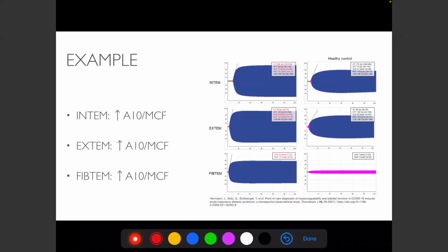So then they may not have gotten their complete dose, and you may or may not be privy to that information when they come out. Right. So rather than just incorrectly dosing for the heparin weight that you got in the OR, because everything's so standardized, sometimes things creep up where they may not have gotten an appropriate dose because of a reaction. Yeah, I thought the protamine stuff was really interesting.